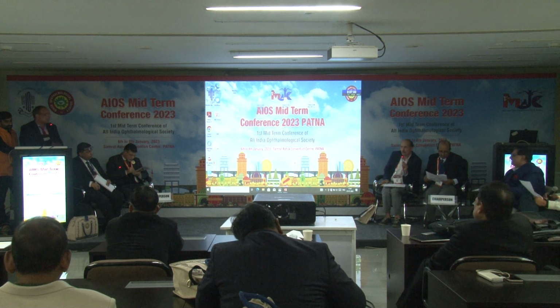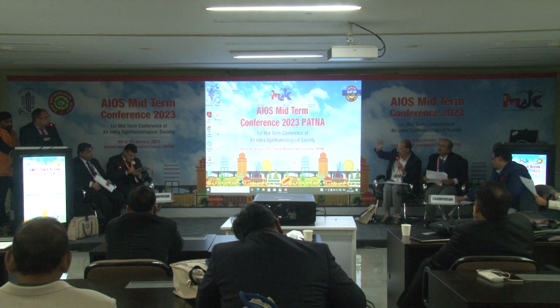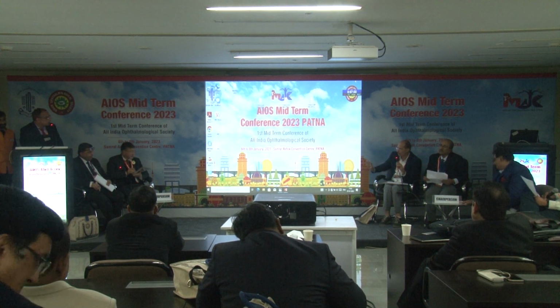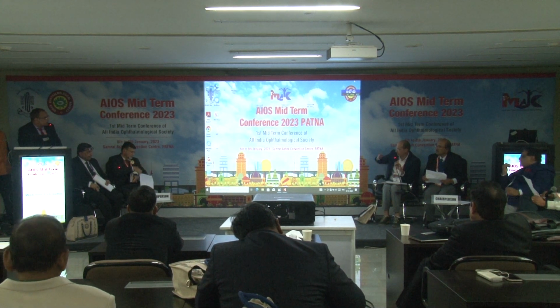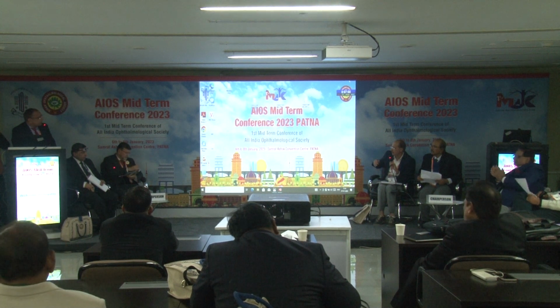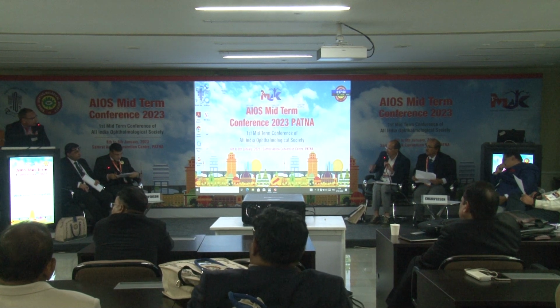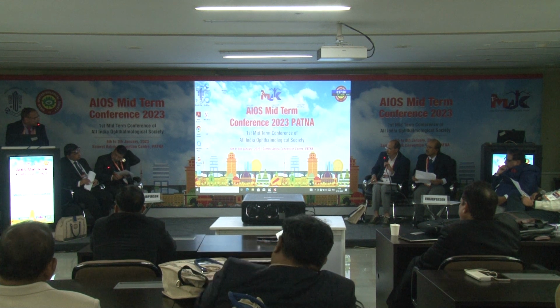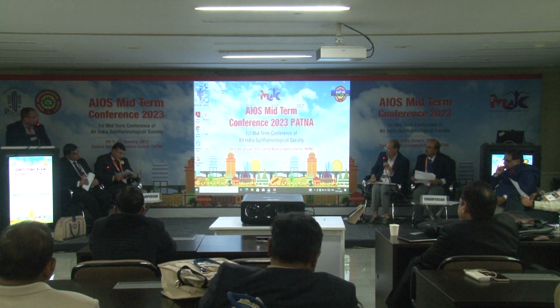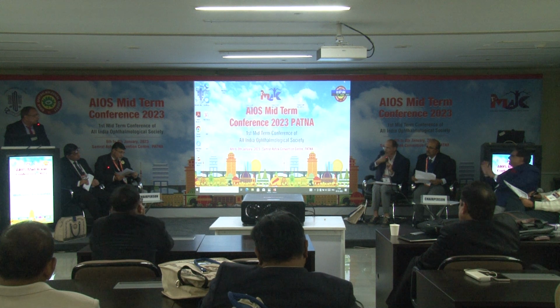What I was wondering was, what was your innovation in that? Because the server is doing something on its own that you didn't innovate. Your job was just to input the data and do the clinical annotations. Annotating and grading the images, and on the basis of this AI algorithm, we were able to make a referable system, a binary system, for a particular disease like glaucoma. So there is cupping, this much cupping, this much of ocular biomarkers, so I think the patient needs a referral. Again the same thing, I think, sir.